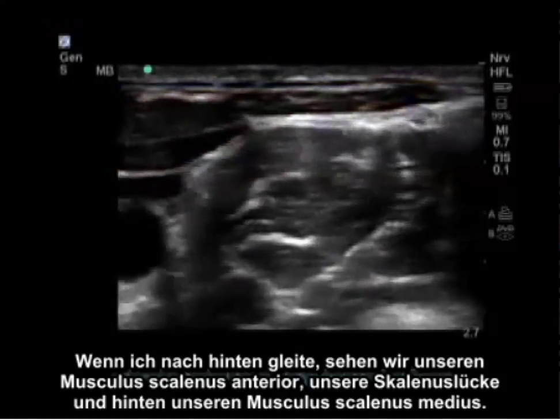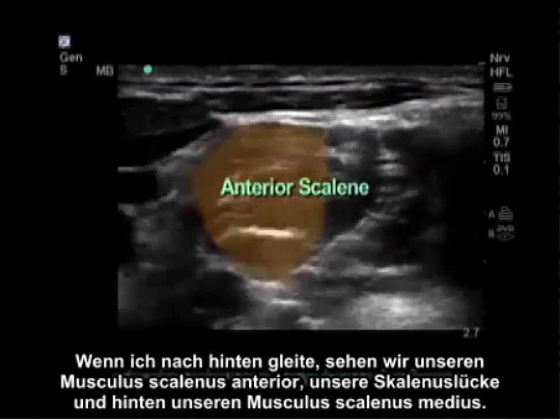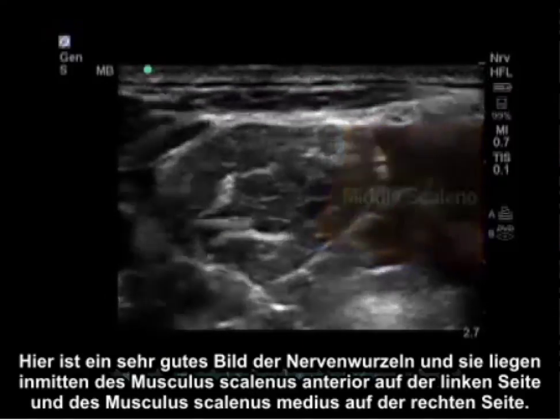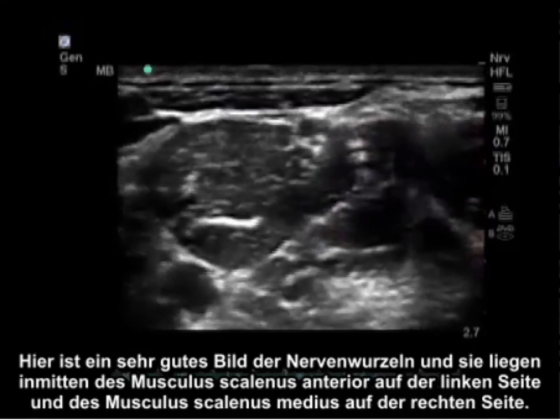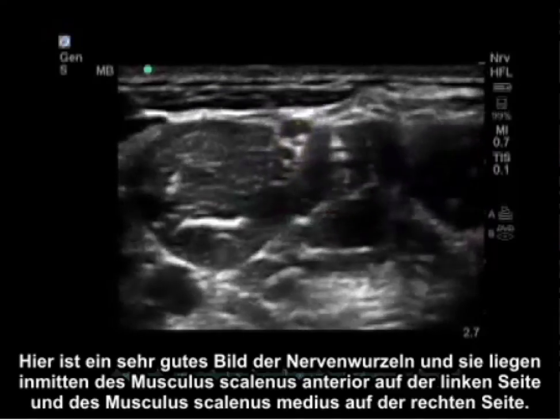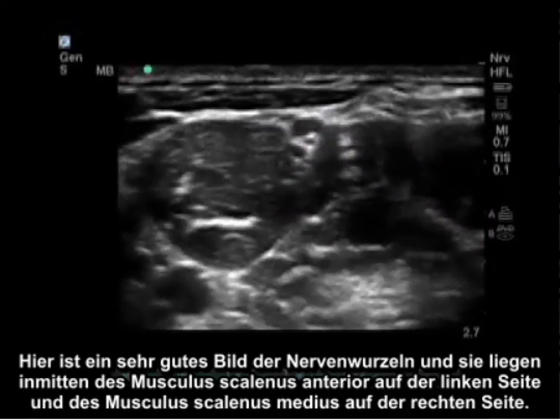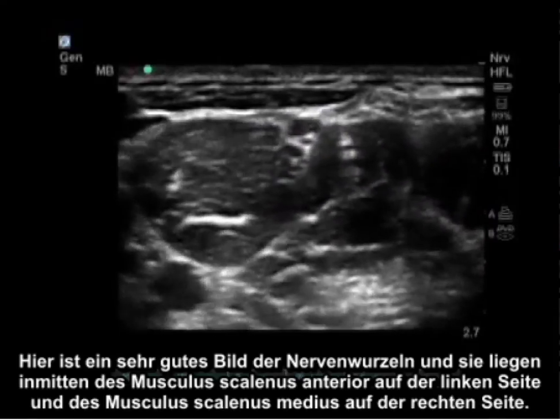As I slide posterior, we have our anterior scalene, our interscalene groove, and posteriorly our middle scalene. Here is a very good picture of the nerve roots — they are sandwiched between the anterior scalene on the left and the middle scalene on the right.